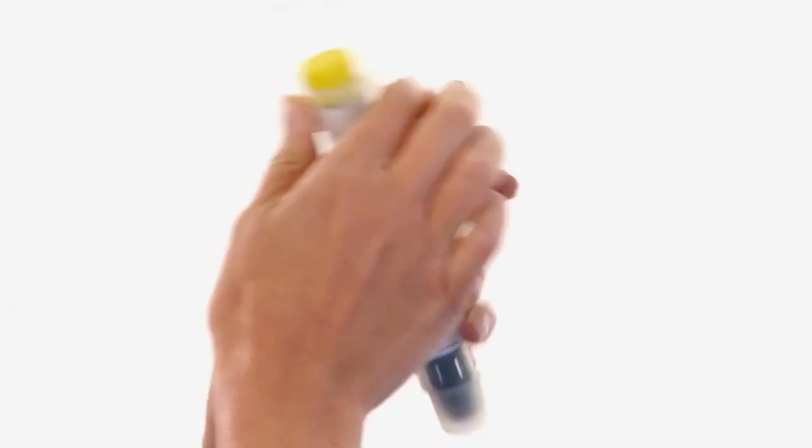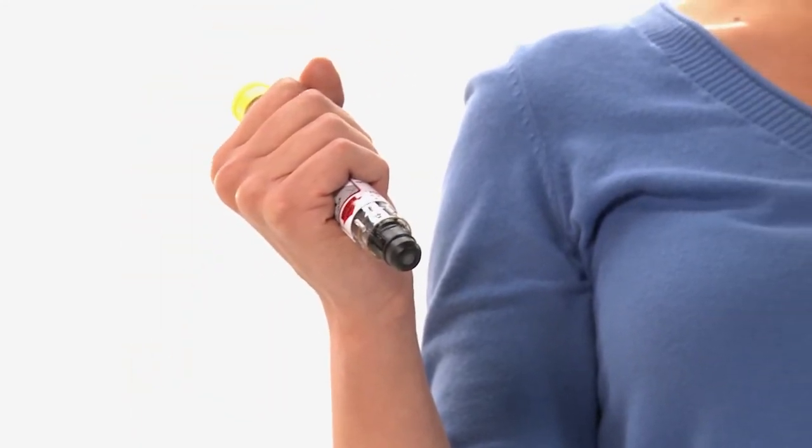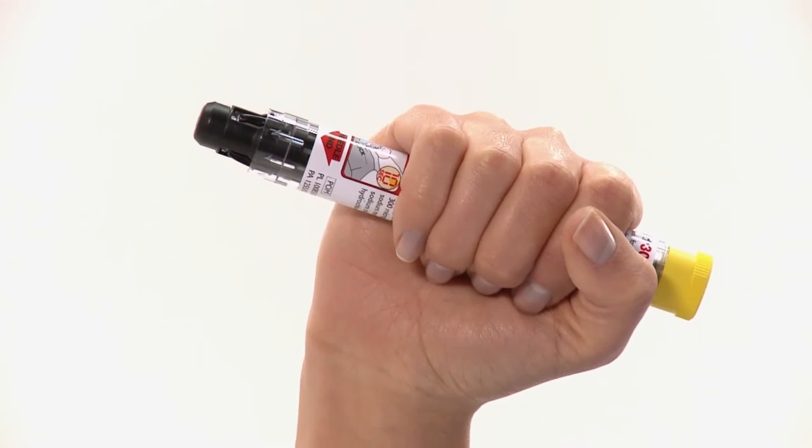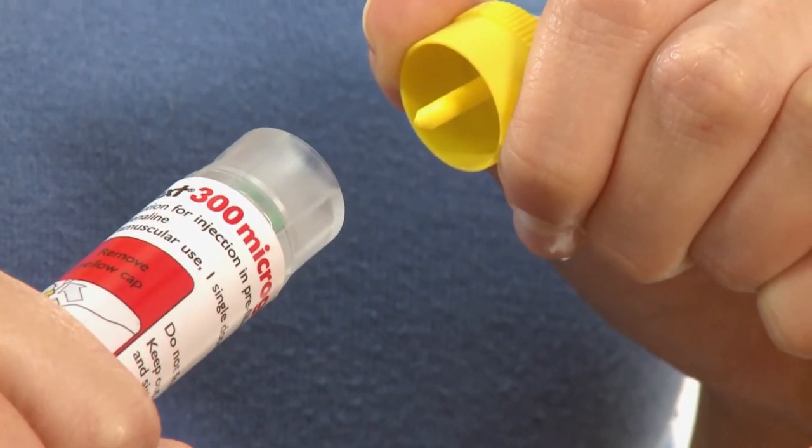You should remove your Jext from the flip-top case. Grasp the Jext in your dominant hand with your thumb closest to the yellow cap. Pull off the yellow cap with your other hand.